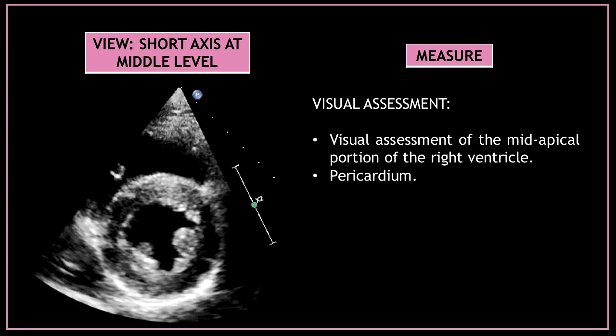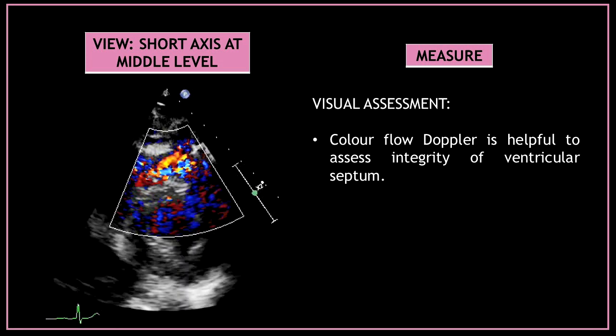In this view we can also visualize the right ventricle, so do a visual assessment of the middle apical portion of the right ventricle. You can also do a visual assessment of the pericardium. At this level you can also look for any septal defects — using color flow Doppler is very helpful here to assess the integrity of the left ventricular septum.